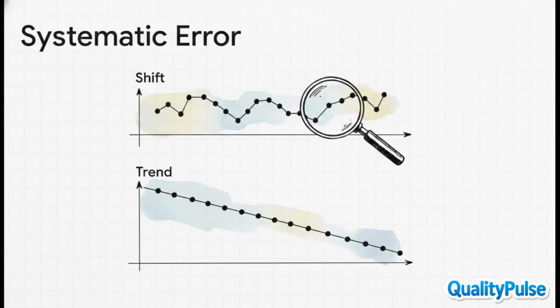So when you're examining your chart, you're actively hunting for specific visual cues that warn you you're losing test reliability. For systematic error, you're looking for two big things. First, a shift. This is an abrupt, sudden change where consecutive runs suddenly fall completely on one side of the mean. Or you're looking for a trend. This is a gradual change moving steadily in one direction, like a line just slowly, inevitably marching up or down the chart, day by day.